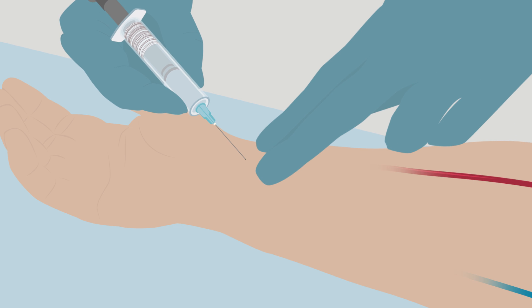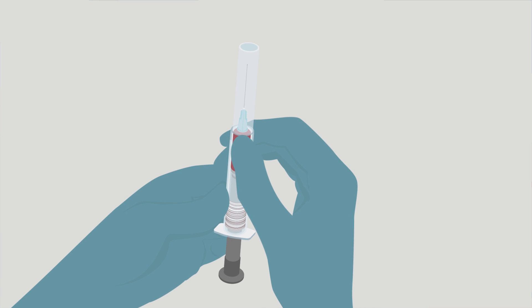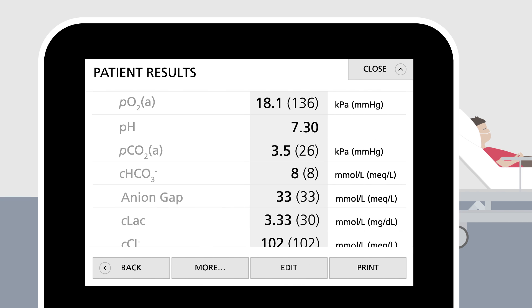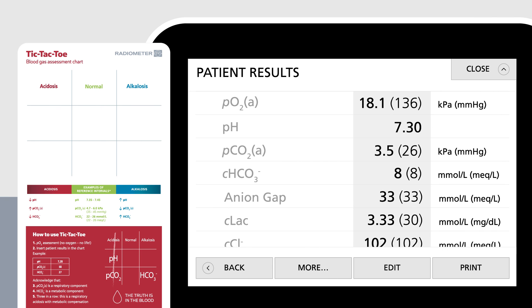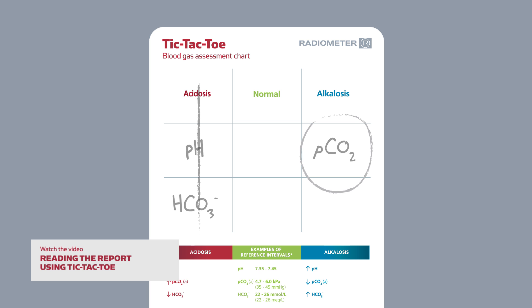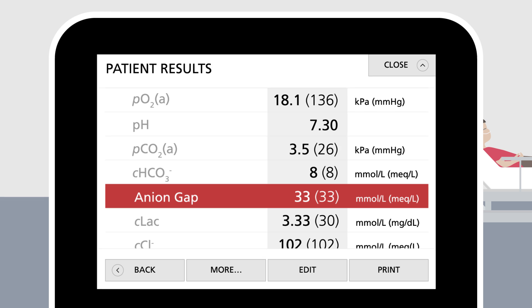Due to the severity of his condition, an arterial blood gas sample is collected. Here are the relevant patient results from the ABL analyzer. To interpret the report, you can use the simple tic-tac-toe method, where you note pH, pCO2, and the concentration of bicarbonate in the appropriate columns according to the reference intervals. The assessment reveals metabolic acidosis with slight respiratory compensation. The ABL analyzer also calculates the anion gap, which is highly elevated.